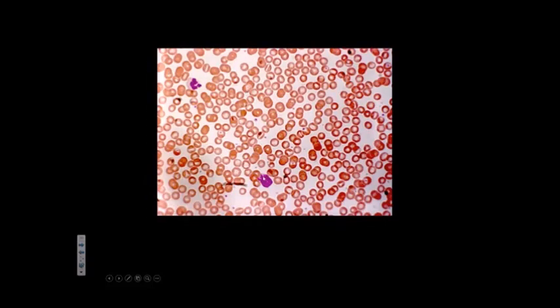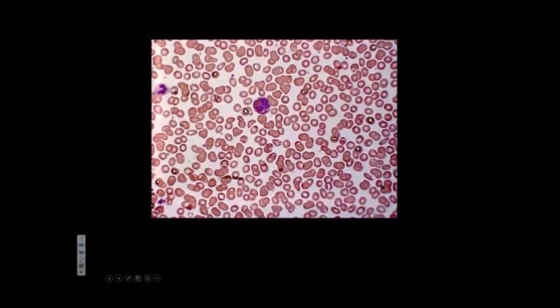And I don't know what that is. Kind of boogered up. Okay, this is definitely a neutrophil, so let's move on. It's a neutrophil and monocyte. Well, I don't know. Okay. But I would go with the monocyte. This one should be easy. Neutrophil and eosinophil and a neutrophil, right? Right.